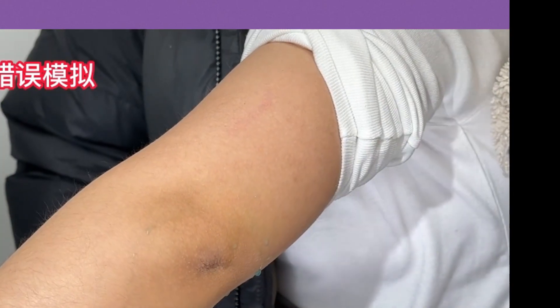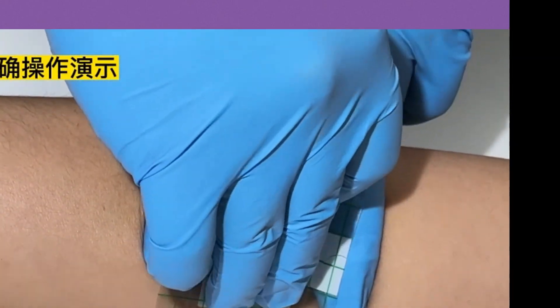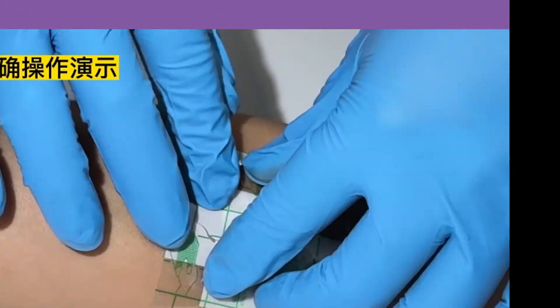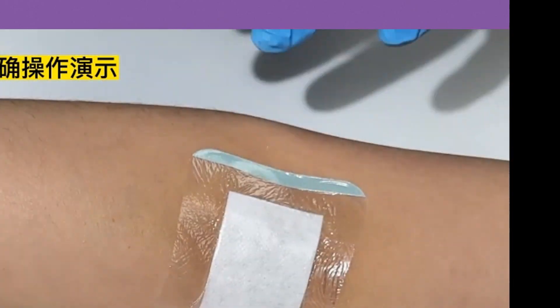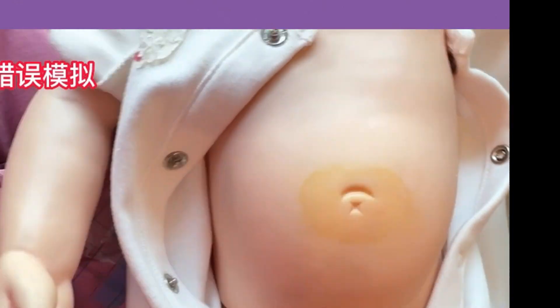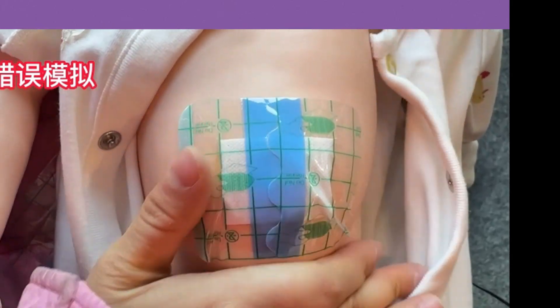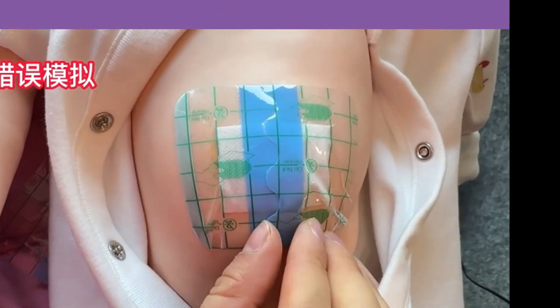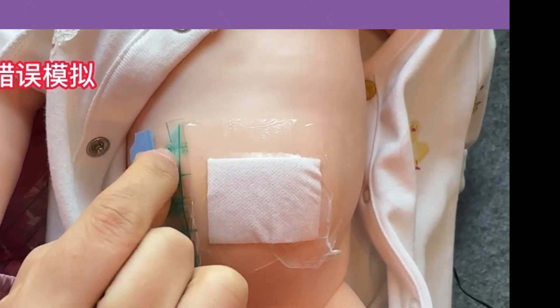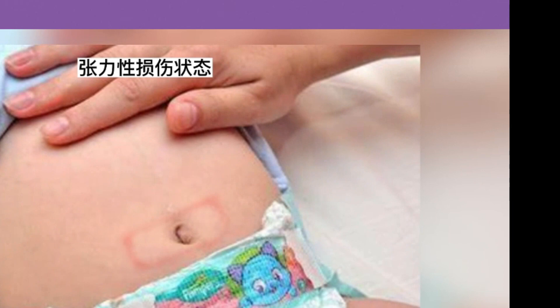The first point: newborns will have small wrinkles around their belly button. If you directly stick the umbilical patch on, this creates an uneven surface between the skin and the patch, making it flexible and easy for water to seep through. The correct approach is to use your fingers to gently spread the skin folds until they are smooth, then apply the patch. This way, there is no gap between the patch and the skin, and no more water seepage.